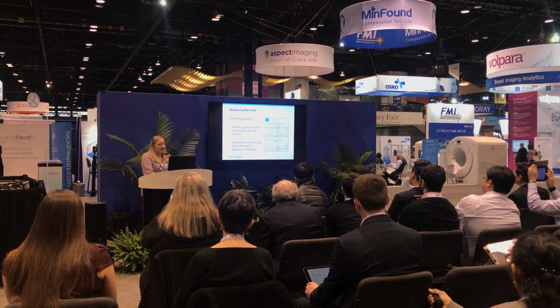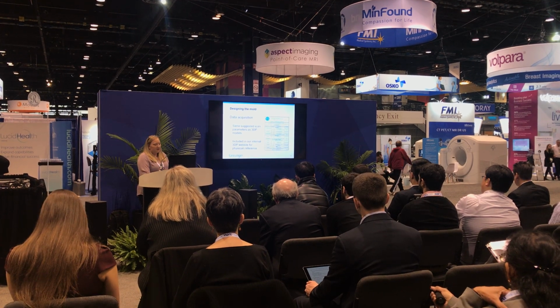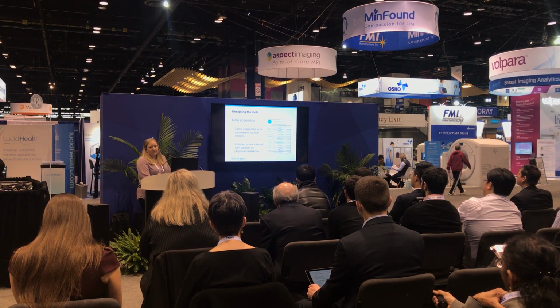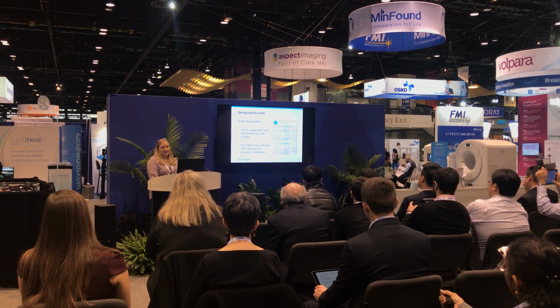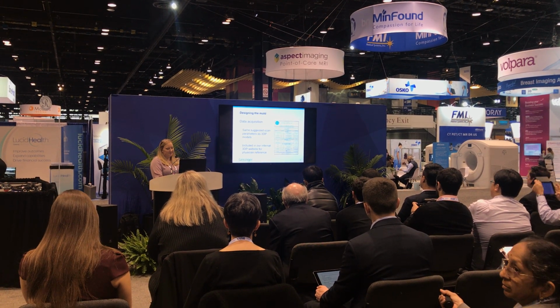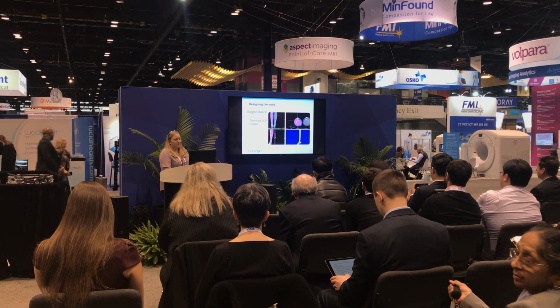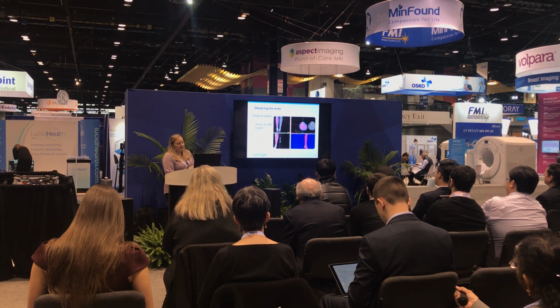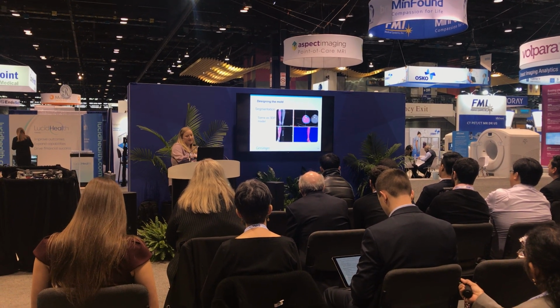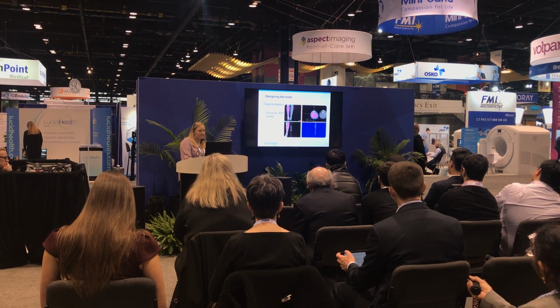So, like I said, data acquisition is the same as any 3D printed model. This is one of our forms that we have on our internal website for physician reference, just to make sure you have the best imaging first. Segmentation is also the same as a 3D printed model. So you're just gonna segment, in this case, the bones, muscle, fat, skin. You'll be able to see when I turn this that that's where we simulated the wound.